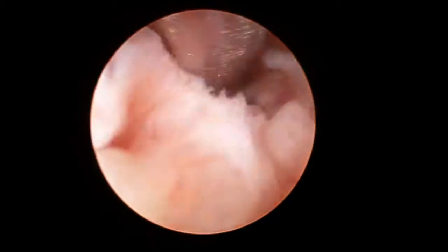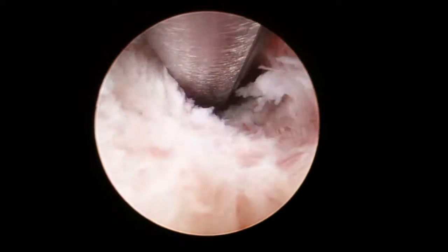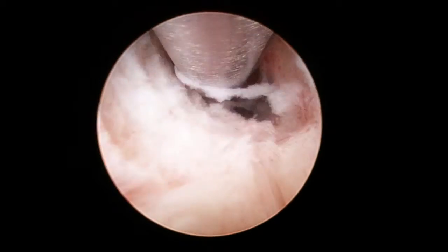The window into the upper uterine cavity is used to help identify normal anatomy and extend the dissection laterally towards the side wall. Rather than cutting and separating adhesions as is typically done with the scissors, the MyoSure device is used to remove the band of scarring to normalize the uterine cavity.